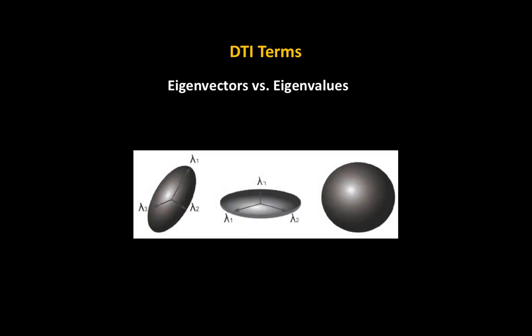OK. So last month, we used a package called TBSS, or Tract-Based Spatial Statistics. And that used that DTI approach I was talking about. So let me define some of those terms so we get a clearer contrast of what's going on with MRtrix. With DTI, we have a couple things, eigenvectors and eigenvalues. So all that diffusion that's happening, we can fit a mathematical model to represent what that looks like.